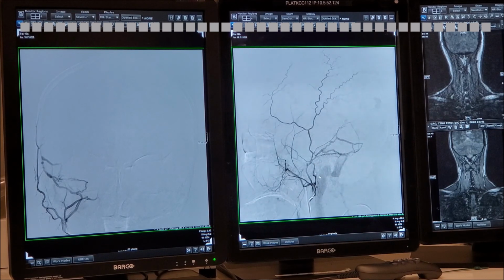That's how you identify it. Now, the middle meningeal artery is interesting because you have this branch to the petrosal, which is, of course, the one supplying the fistula. But from the accessory meningeal, you have a dominance to the anterior branch. If you remember, we used this curve and this curve, and in between is the ILT. Between those two, we look for the anastomosis with the internal carotid. So it's a variation of the middle meningeal.